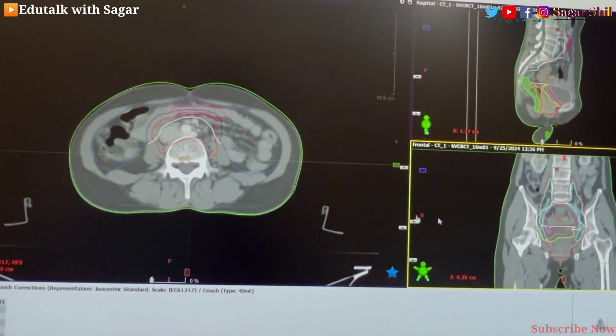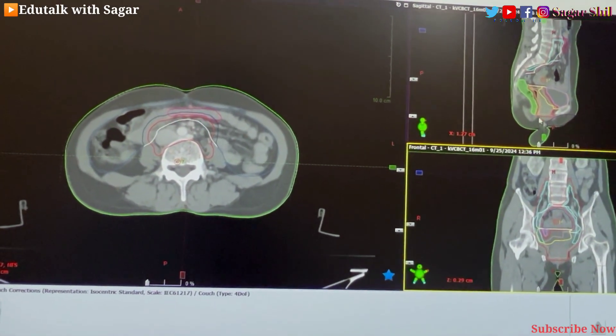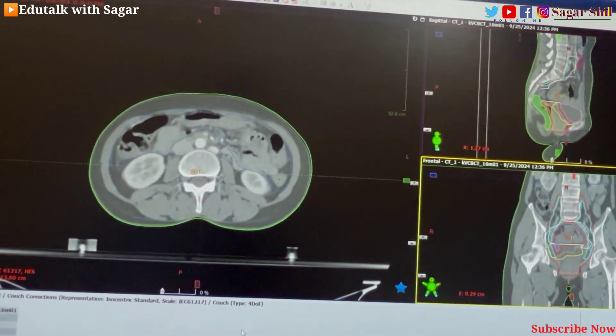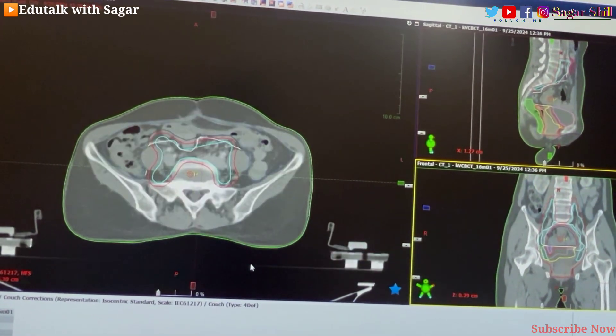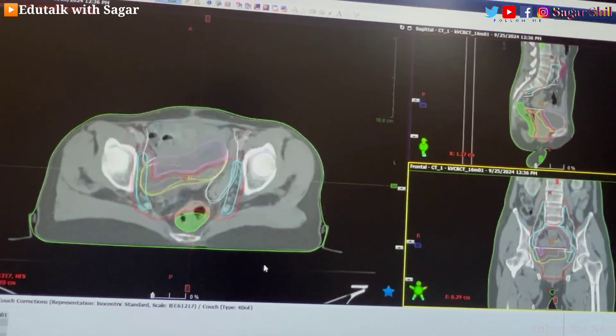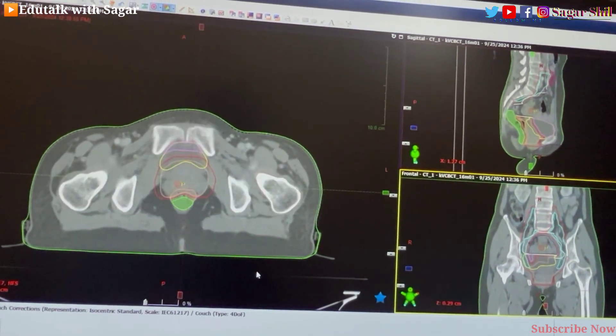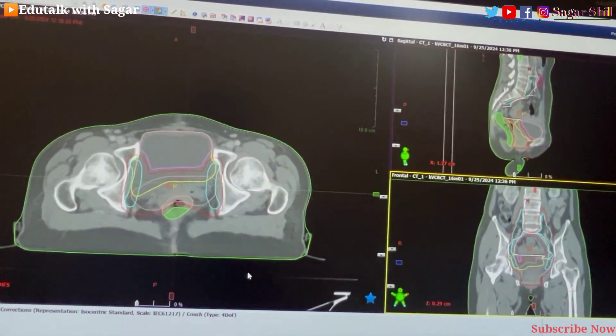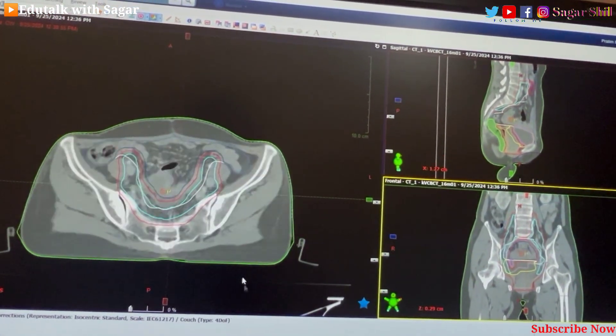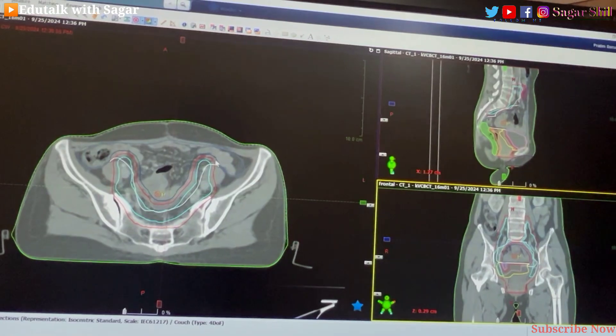Let's see how I am going to match CBCT images. Please see this video to the end. So here, this is one pelvic case — this is an endometrium case. In this video I am going to show you how to match CBCT images in the pelvic region and what things we should keep in mind.